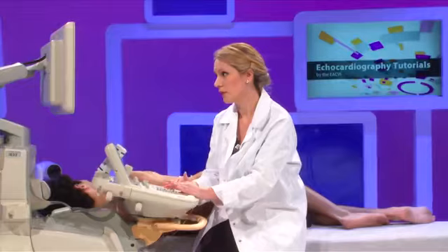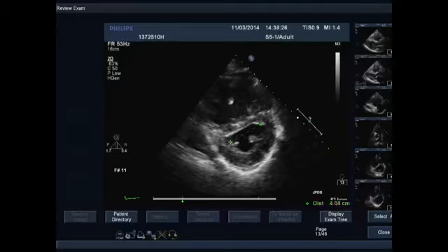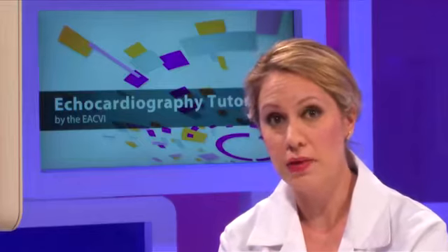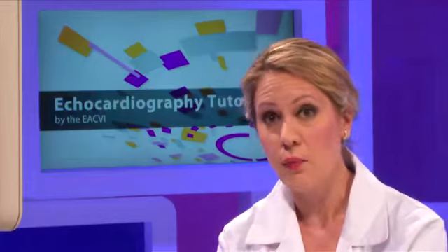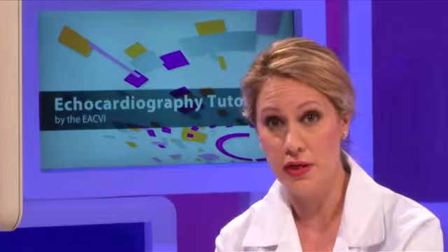In end systole, if we do the same and get the dimension parallel to the septum versus the dimension perpendicular to the septum, the ratio, as we may see, is greater than 1, and that indicates right ventricular pressure overload. It is important to say that in patients with pure volume overload, the eccentricity index will be greater than 1 only in end diastole, whereas in patients with pressure overload, the eccentricity index will be greater than 1 both in end systole and end diastole. And it is very important to differentiate between pressure and volume overload.